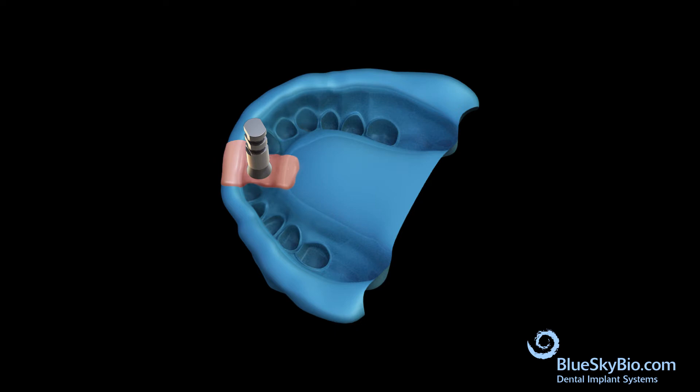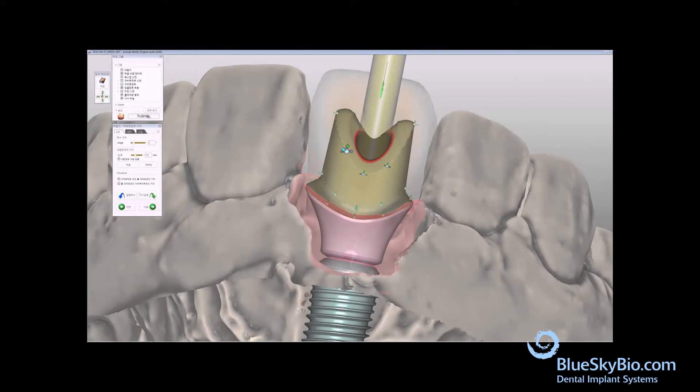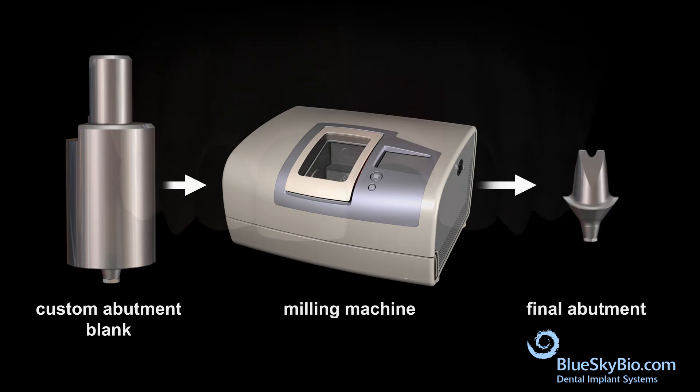Inject pink soft tissue model material around the analog, then pour model stone in the impression so a model is made. Remove the impression transfer from the stone model. Design the abutment in CAD software, then use a custom abutment blank to mill the final abutment.